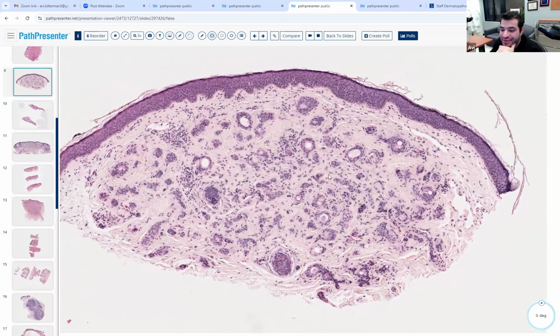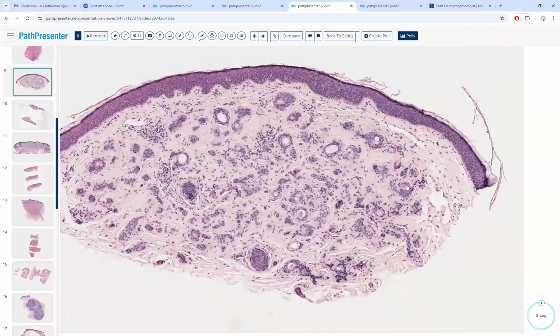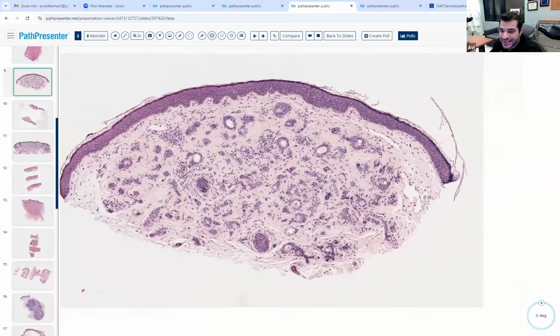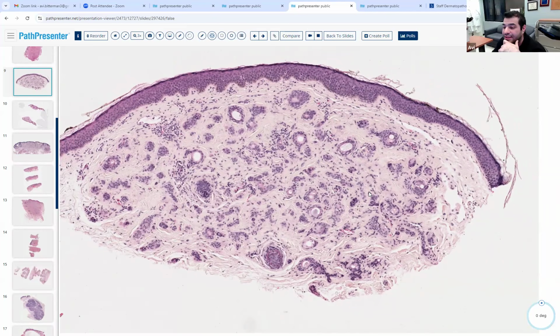What do you see in terms of the tumor? So we mentioned this Paisley tie, we mentioned ducts. Any cysts or no? None. No cysts. And what about its size, its symmetry, its circumscription? It's well circumscribed. It's relatively small. Yeah.